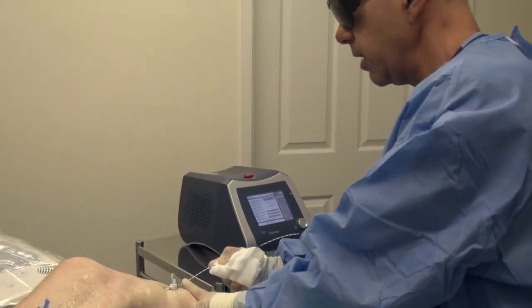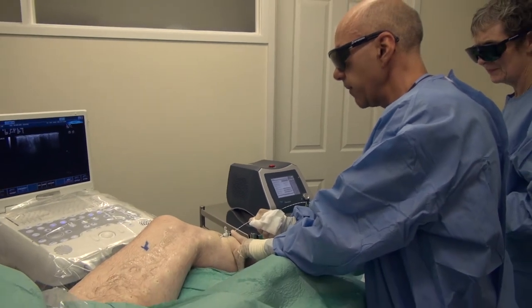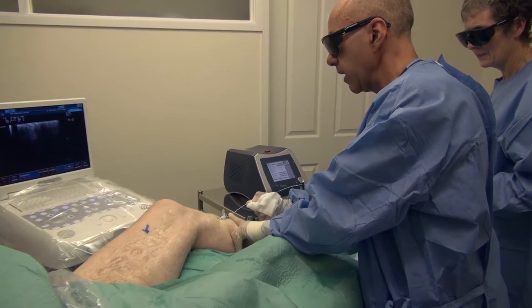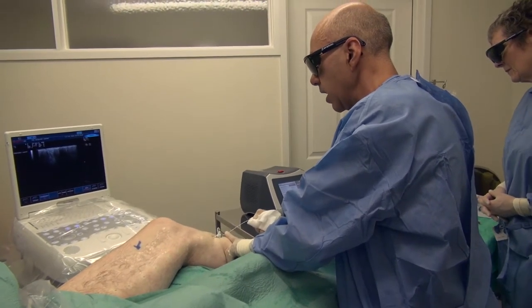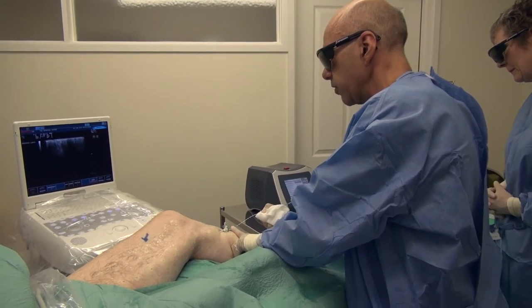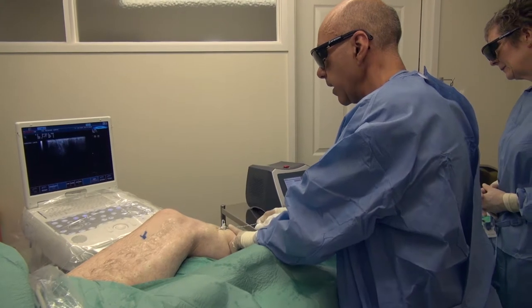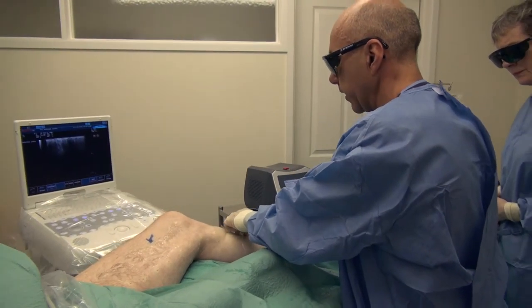Endothermal ablation — that is, heating the vein from the inside using laser energy or radiofrequency energy — is the number one choice now for the treatment of superficial vein reflux caused by reflux in the great saphenous vein, the vein that we're treating this morning, or the small saphenous vein, the vein at the back of the calf.